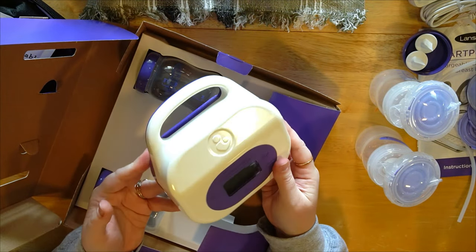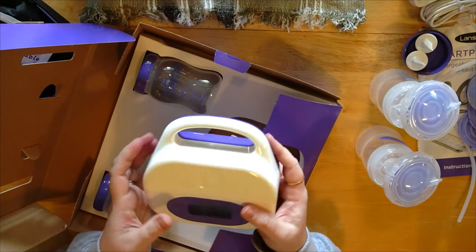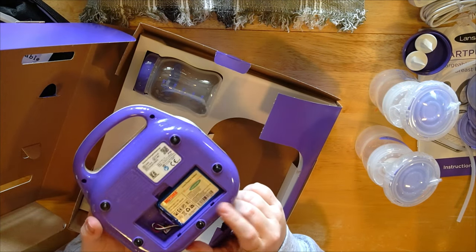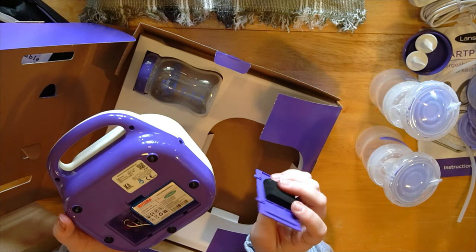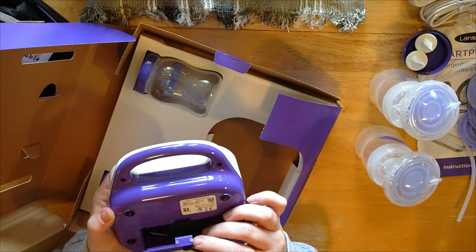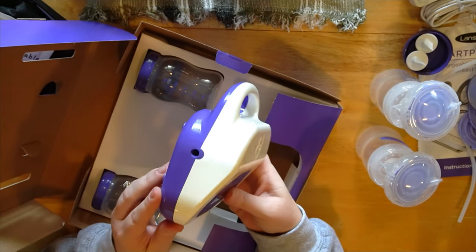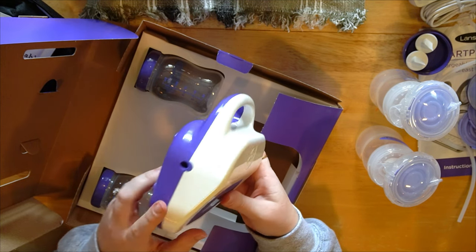The pump does look relatively similar to the previous 2.0 versions. It does feel a little bit bulkier and heavier, but I'm assuming for good reason. It says it's rechargeable right here on the back — very cool. This is typically where the double-A batteries used to go if you wanted battery power, but now they've got a rechargeable lithium battery in there.